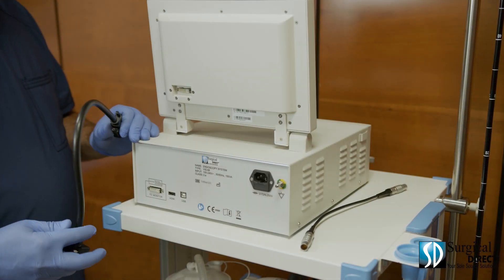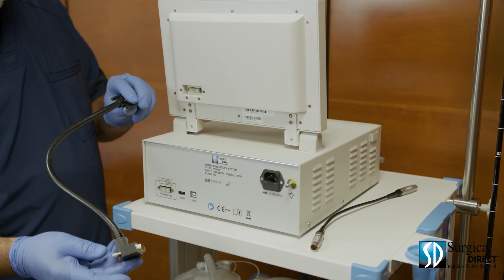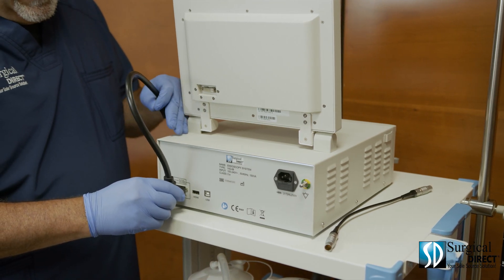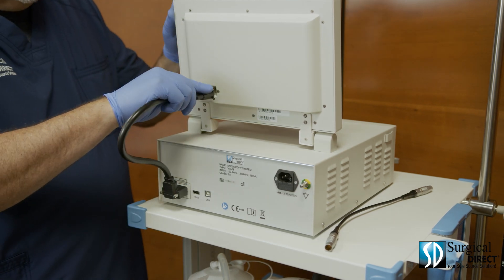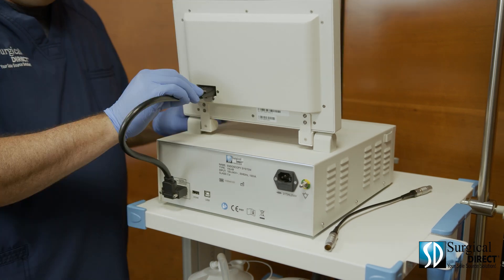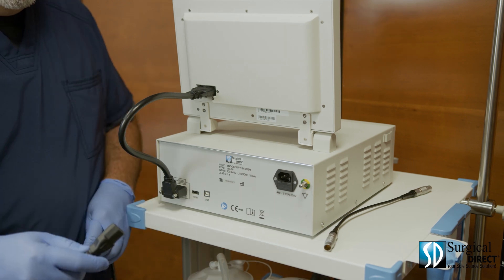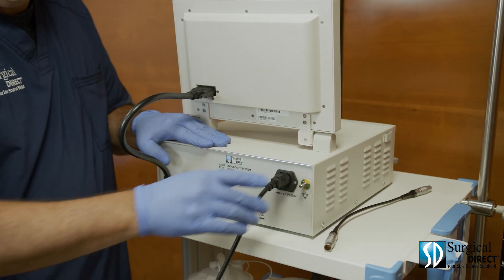Now we'll prepare the video endoscopy system for use. First, attach the right-angled end of the video cable to the base of the processor. Next, attach the other end. Be sure to tighten all four screws so there is no interference. Next, attach the supplied power cable to the back of the unit.